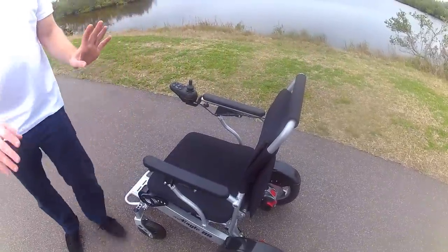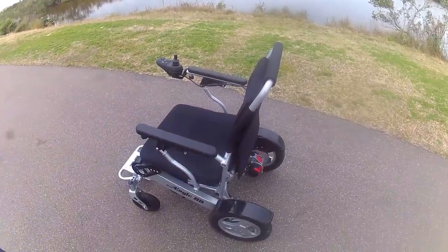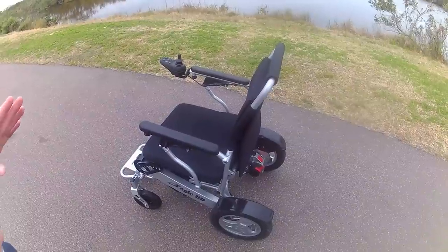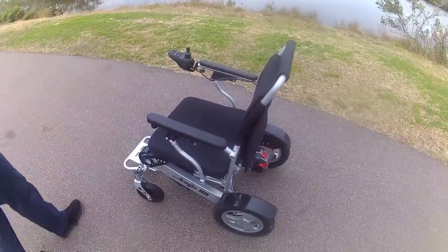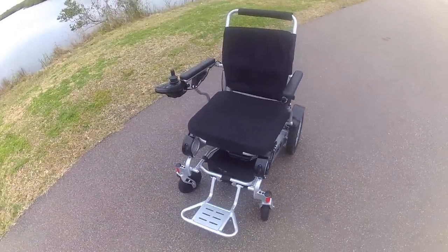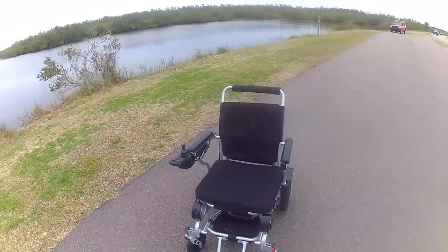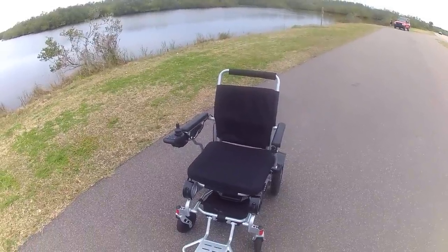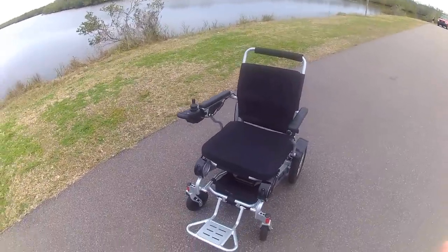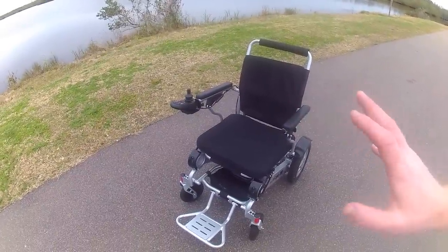One of the biggest questions we get is: can I test drive the chair, is there a place to see it? Unfortunately, the answer is no. In a retail environment, the Eagle is something insurance companies typically will not pay for. Medicare will not pay for this chair because it's considered a recreational vehicle. Therefore, a brick-and-mortar location cannot make the margins they want by billing an insurance company, which is why we're giving you all the specific measurements and details in this video.